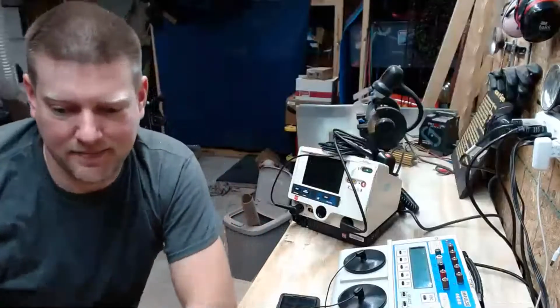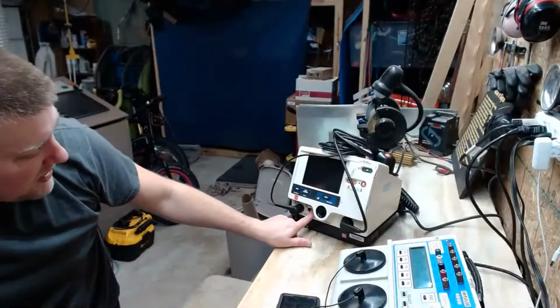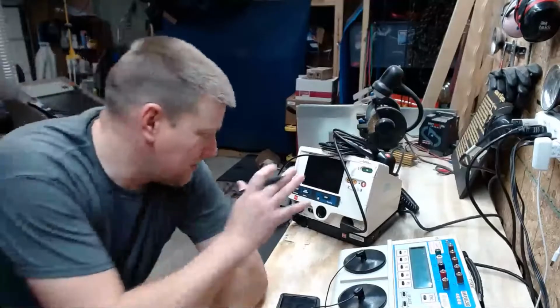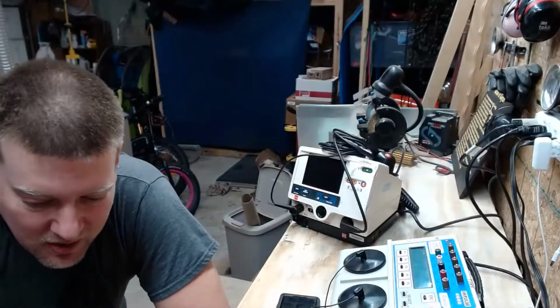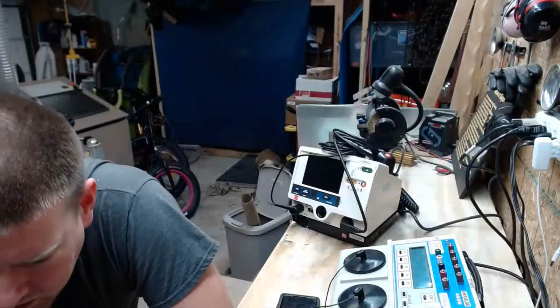No, you didn't. All right. No, you didn't. These defibs, especially since they're getting more complex with the integrated SpO2 and CO2. Again, we're going to go over that sometime in the very near future so you guys know what that stuff even is. But when you check out one of these defibs, you check out the whole thing, and it does take some time.